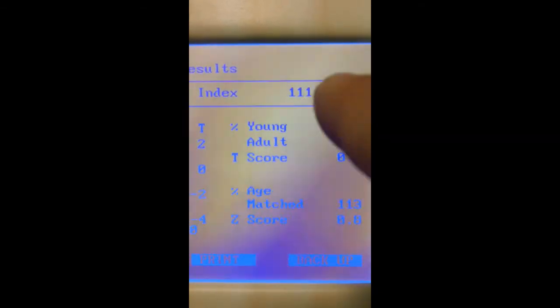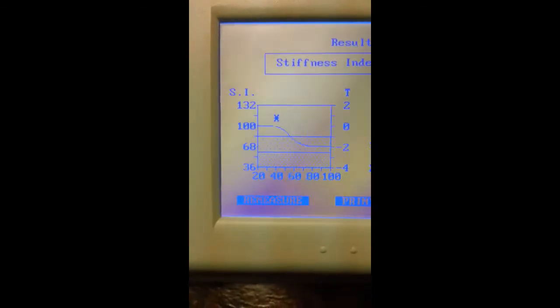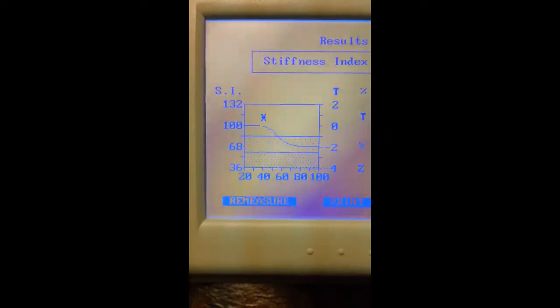You'll see down here on the system here's the information that it provides. The nice thing is it gives you graphical results. The stiffness index is 111. We provide a stiffness index, which is the most accurate way to do it. We can tell you, based on your stiffness index, that your T-score equivalent is 0.7 and your Z-score equivalent is 0.8. The system will actually show you a graphical representation of where you fall on the normal chart based on your stiffness index.